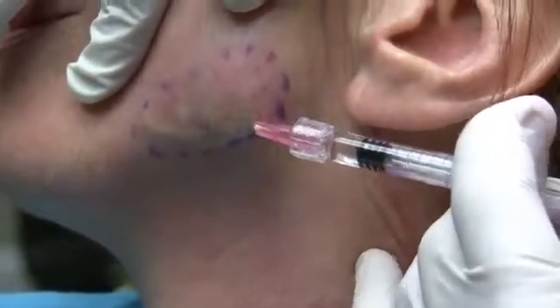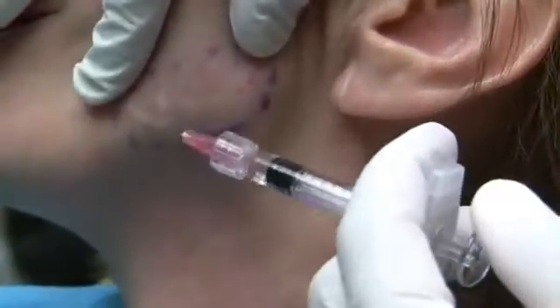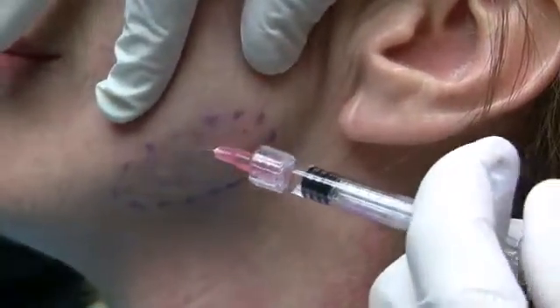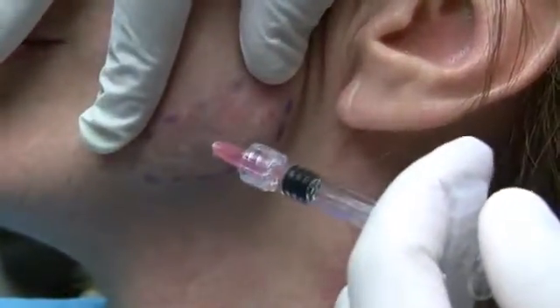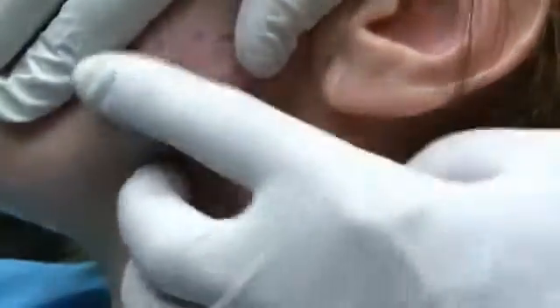You can see how I have my needle bent at a 45 degree or a little less than 45 degree angle, just so ergonomically I don't have to bend over and crane my neck. The facial vein and artery are in this region, as is the marginal mandibular nerve.